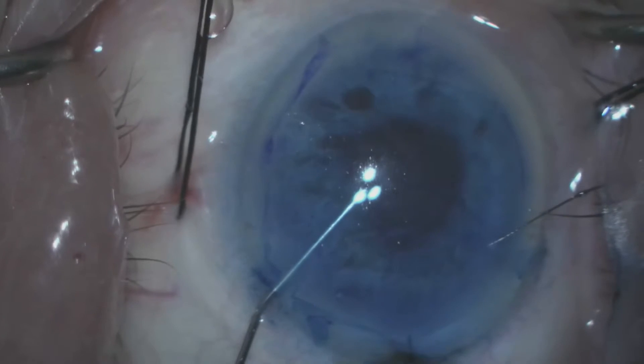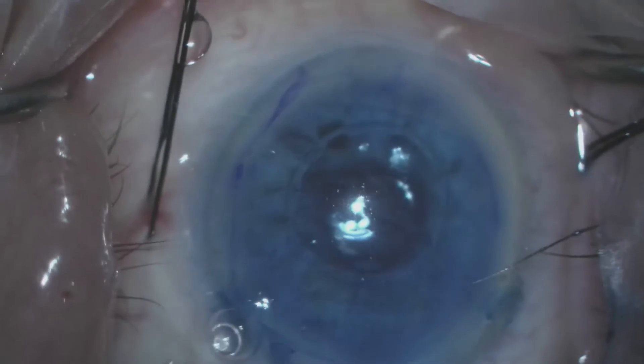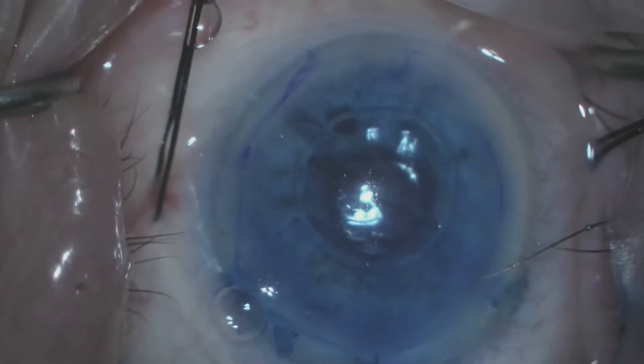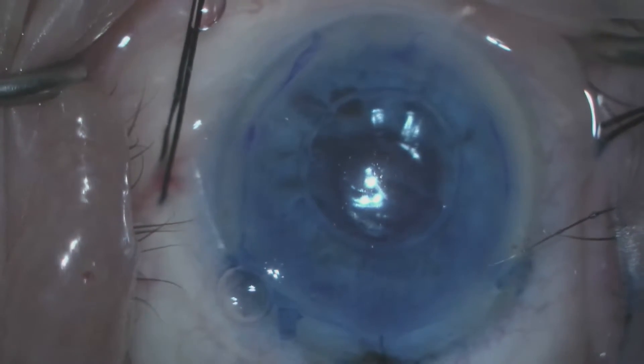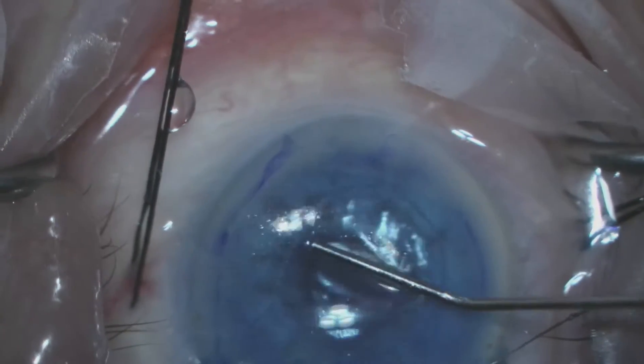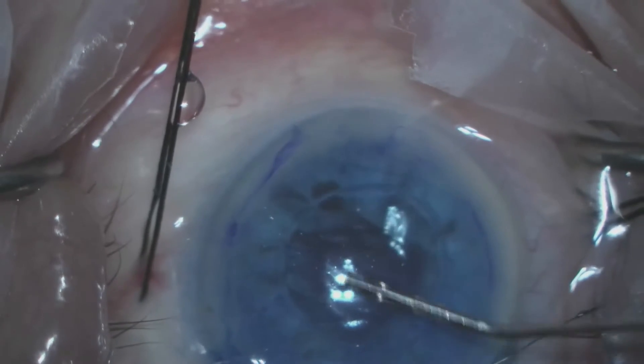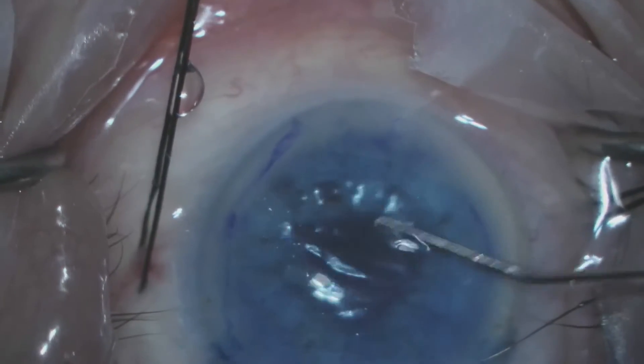The scroll has been flattened. We then use a 30-gauge cannula to inject a small bubble of air and then gently sweep the donor scroll to help it unfold and center it.